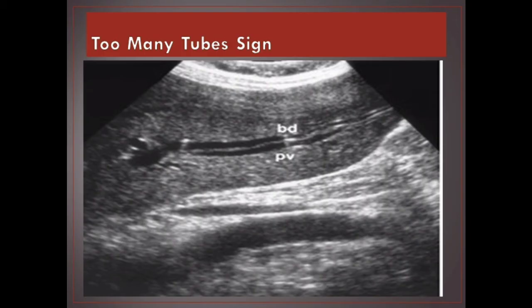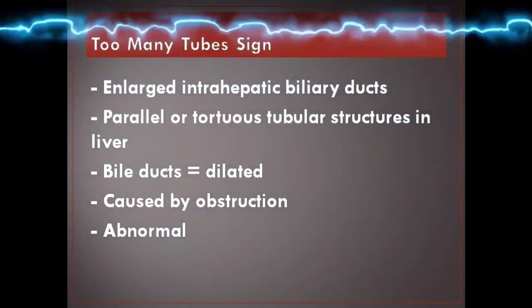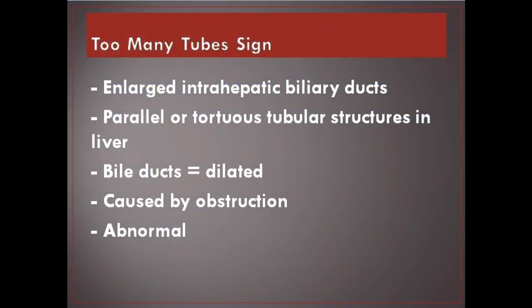Too many tubes sign. Enlarged intrahepatic biliary ducts presenting as parallel or tortuous tubular structures in the liver. Bile ducts are dilated, caused by obstruction. Abnormal.